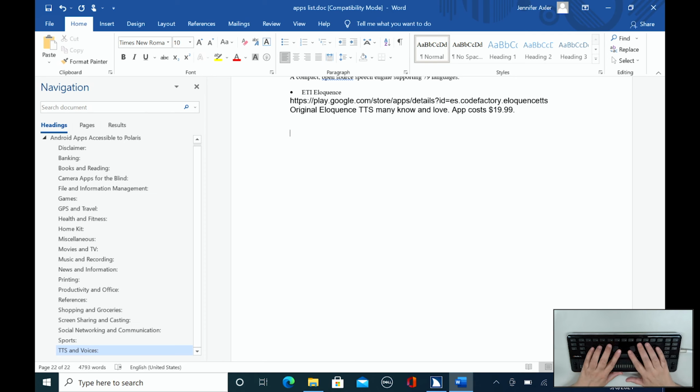Enter. And I'd like to create a new category in this document, similar to the ones that we have gone through. So in order to do that, I'm going to first type in the title. So I'll type in conferencing. And I will press Enter. Conferencing. Enter.